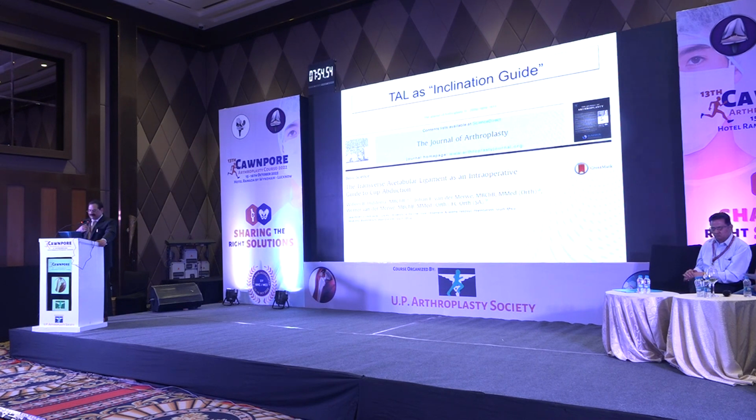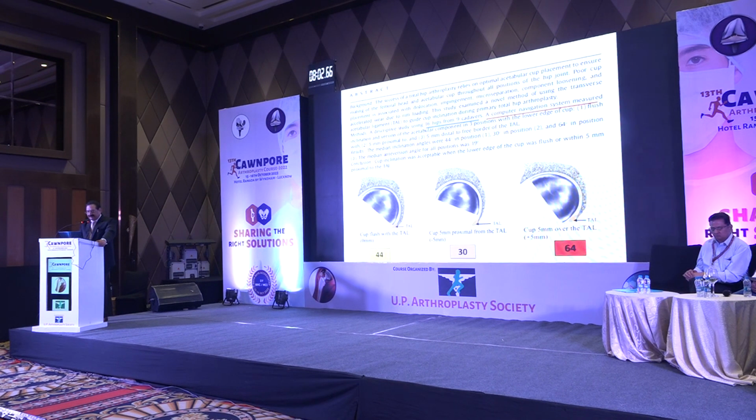The transverse acetabular ligament is a good inclination guide, and this has been proved by cadaveric and computational studies. If your cup's inferior margin is at the edge of the transverse acetabular ligament, the cup is usually 44 degrees closed. If the inferior border of the cup goes inside by 5 millimeters, it closes further to 30 degrees, and if it is outside by 5 millimeters, it is usually 64 degrees. These are cadaveric and computational studies.